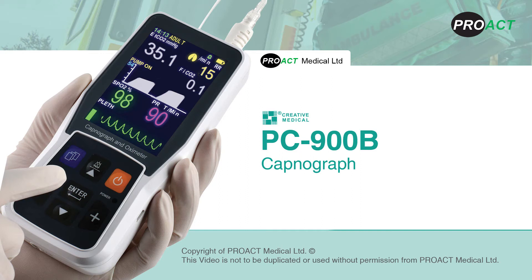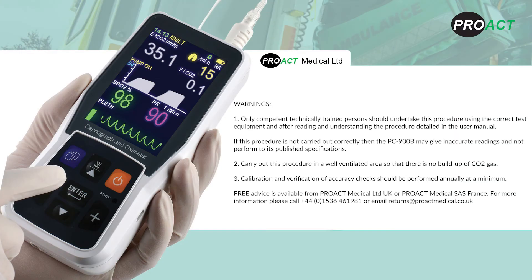Calibrating your Creative PC-900B handheld capnograph and pulse oximeter. Only competent, technically trained persons should undertake this procedure using the correct test equipment and after reading and understanding the procedure detailed in the user manual. If this procedure is not carried out correctly, then the PC-900B may give inaccurate readings and not perform to its published specifications.